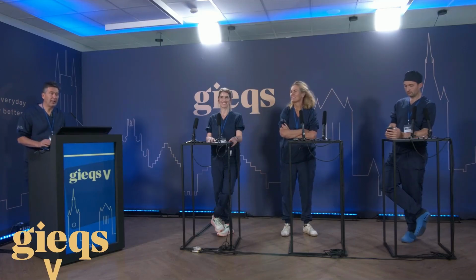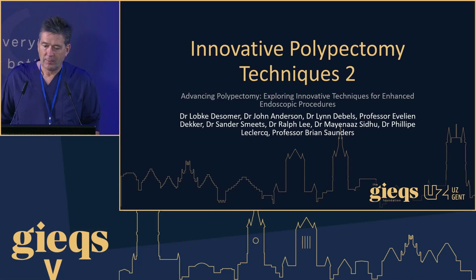Hi, and welcome back. We're going to continue with the theme of polypectomy. We have a fantastic session coming up where we're going to look at some small, intermediate, and sessile polyps. In fact, we'll bring up the session for you.